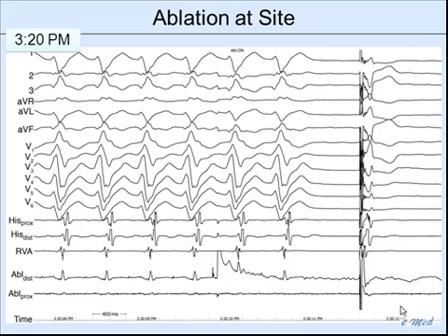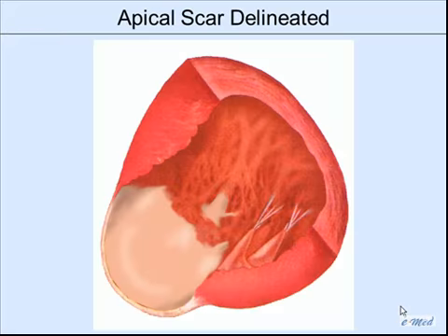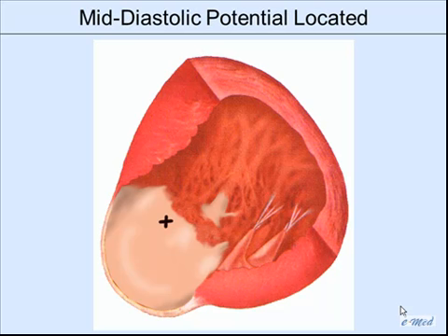Oh yeah, you really do. And this is far more common than not. If you're in the right spot, these are very, very small branches of surviving bundles that go down relatively easily. Now, let's look at some stuff here.